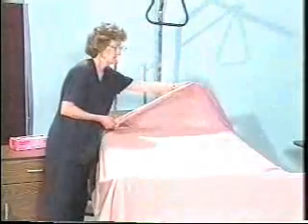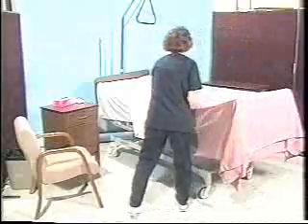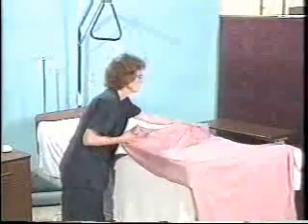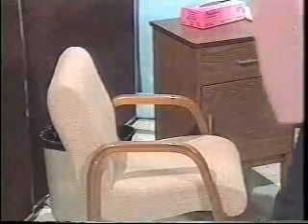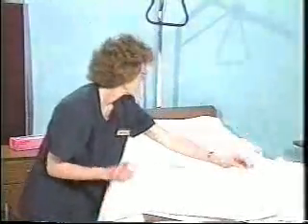Fold the top edge of the bedspread to the bottom, then fold the near side to the far. Fold the top edge to the bottom edge again 1 to 2 times. Place the spread over the back of a chair. Repeat the same steps for reusing the blanket.